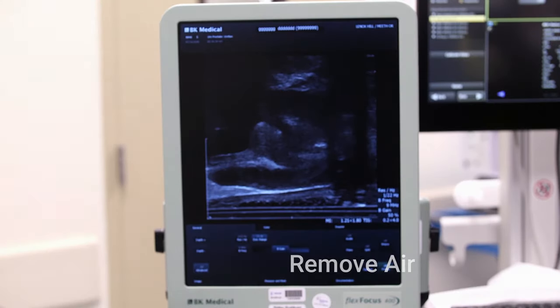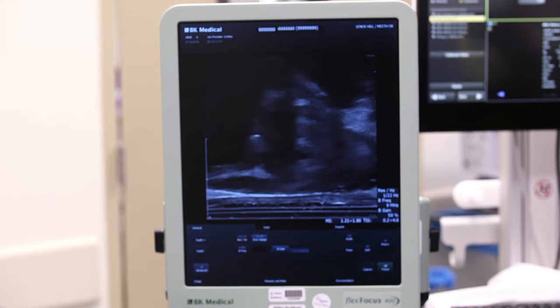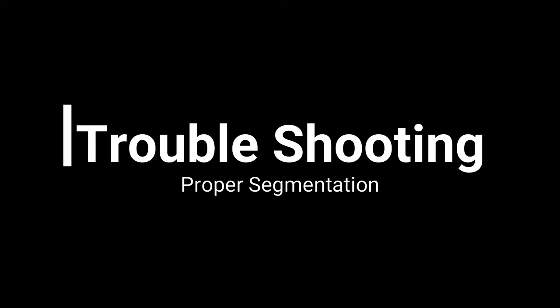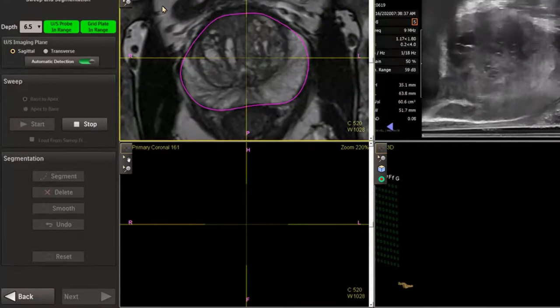Air at any interface produces artifact that prevents adequate visualization. To remove air between the probe cover and the rectal wall, the probe can be wiggled quickly in a lateral direction. The probe should then be relaxed off of the prostate to allow the prostate to expand into its native position and form.